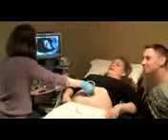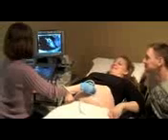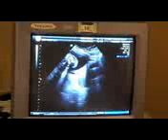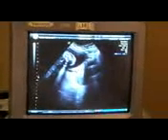Cervix can also be looked at abdominally. And so here's what we're looking at. Here, the fluid is the amniotic fluid. This grayish structure is the actual cervix. And if that looks short, then we have a concern that there can be preterm delivery. So that's the importance of looking at the cervix.